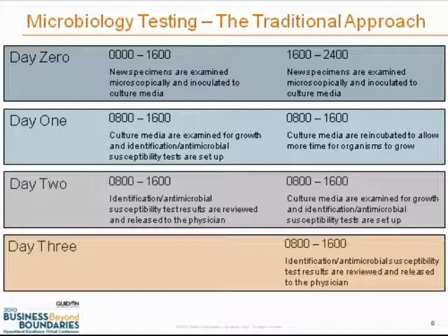p.m., from 4 p.m. to midnight, the following morning at 8 a.m., less than 16 hours of incubation has taken place, and those culture plates are not ready for further work. And so in the traditional approach, those culture plates are just put back into the incubator and left for another 24 hours. That brings us to day 2.